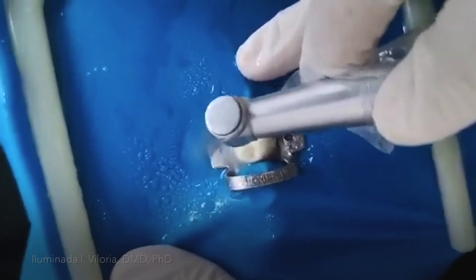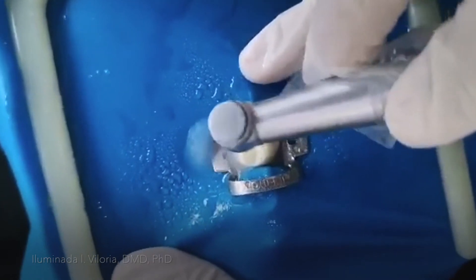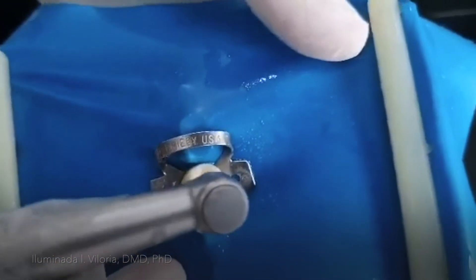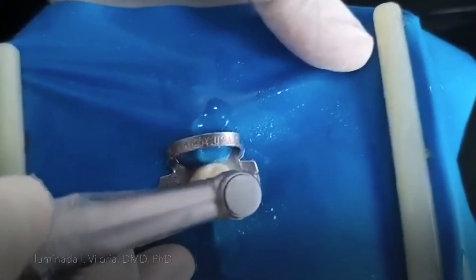Follow the long axis of the shank of your round burr. I have changed my long shank round burr into a bigger one, and then I'll start unroofing again with an outward stroke.